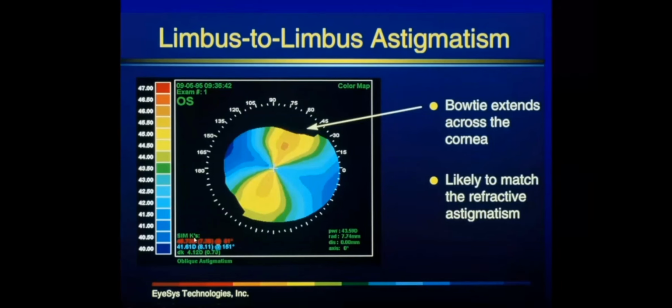The reason is that for topography, the central cornea is not measured; rather, the information is extrapolated from the peripheral parts of the cornea to the center. That's why they call it simulated K readings. So quite often doctors may not rely on topography for the K readings, but rather they look at the keratometry for more accurate central corneal readings.